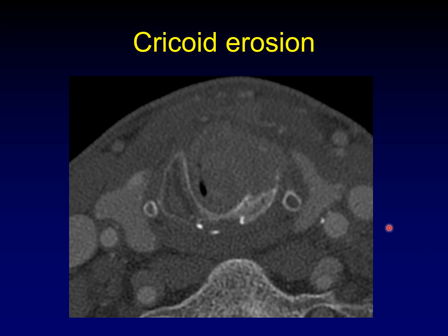Here's an example of cricoid cartilage erosion. You can see the circle of the cricoid cartilage interrupted by an erosive mass. Notice that there is sclerosis of the cartilage adjacent to the erosion — this is typical of laryngeal cartilages affected by tumor. There will first be a reactive sclerosis that may occur even in the absence of true erosion, followed by the more discrete erosion of the cartilage.